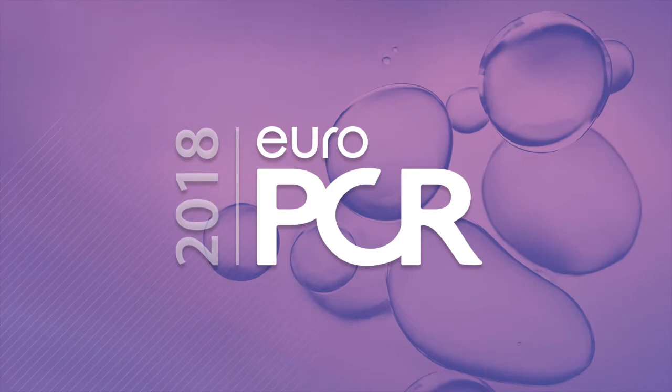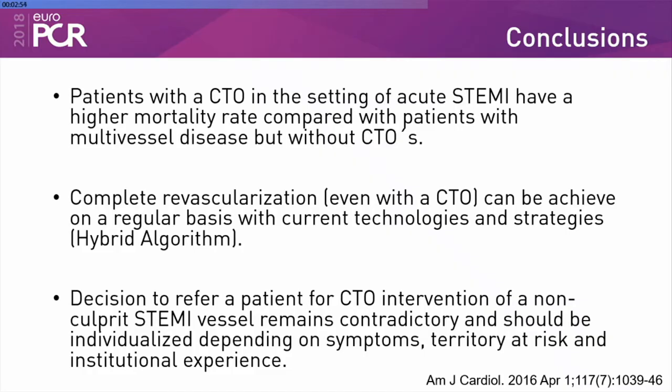Maybe we can maintain this slide, okay. I think we have two different things to comment on this very interesting case. The first one is when we are dealing with multivessel disease and acute MI, when to treat, and I'll come back to that to ask a question to the audience. And the second part is the very elegant way to treat and solve the chronic occlusion.